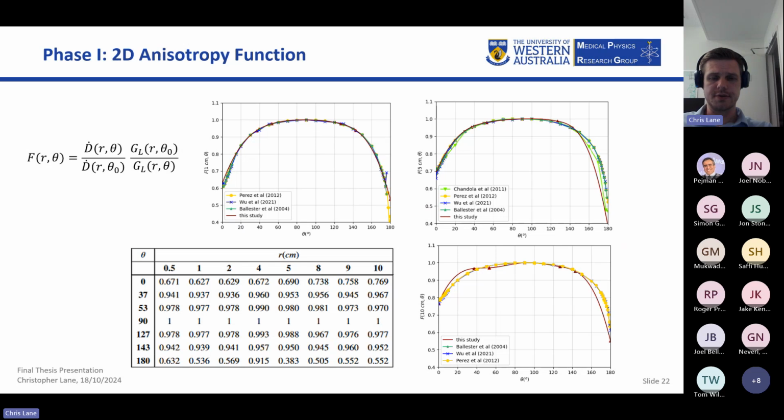But based on the data I got, I thought it seemed to agree fairly well. The further out it gets, the more uncertain it seems to get. But I think partly that may have just been the spline fit I used to make the curve itself. I think the data's not too bad. And again, the number of histories I'm using is probably slightly less than I should have, but I think it's consistent enough that I was confident it was working properly.